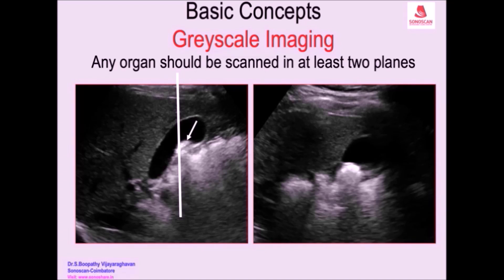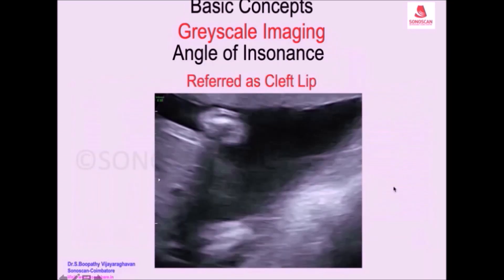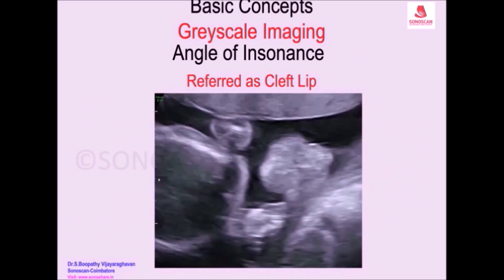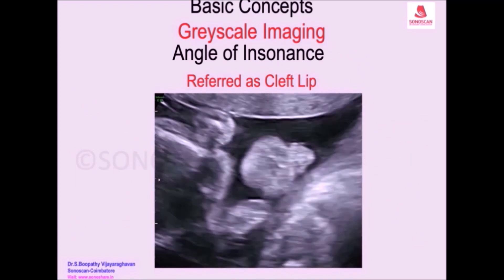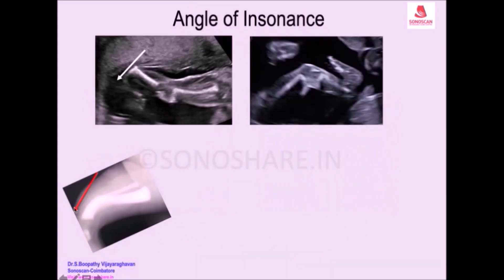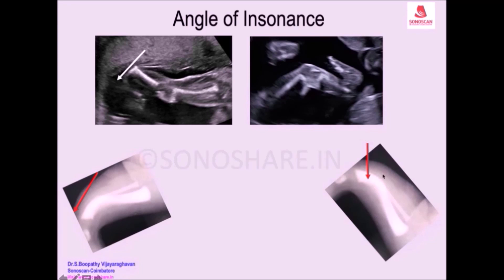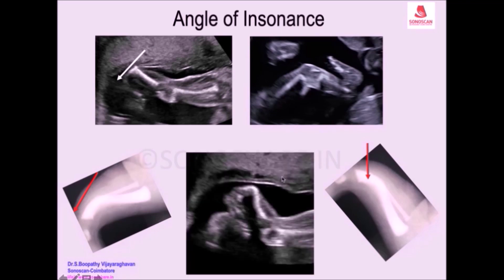The structure is not seen well because what we are interested in is the upper margin — the upper lip. Here you see this part of the tibia is parallel to the beam, and when it is parallel, you get a drop-out artifact at that particular angle.